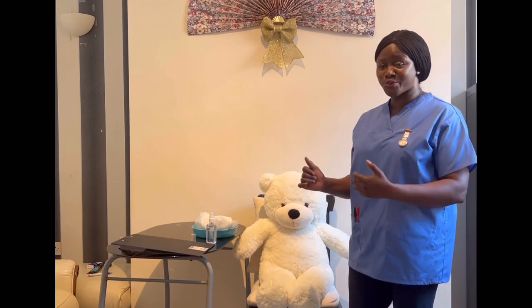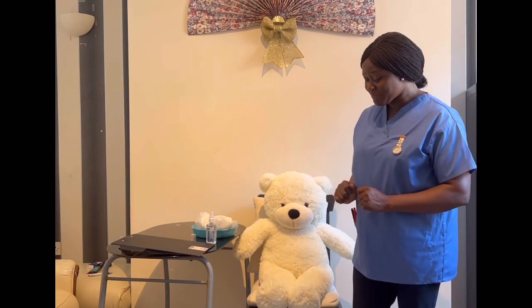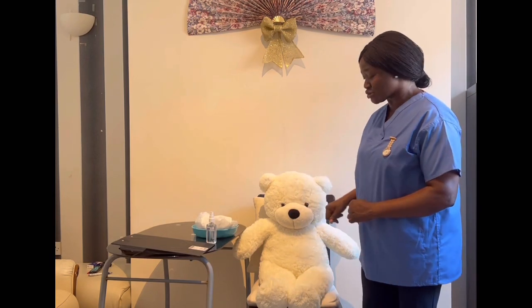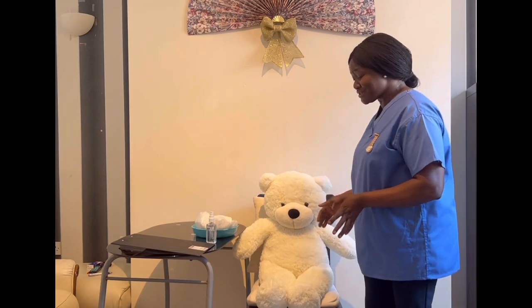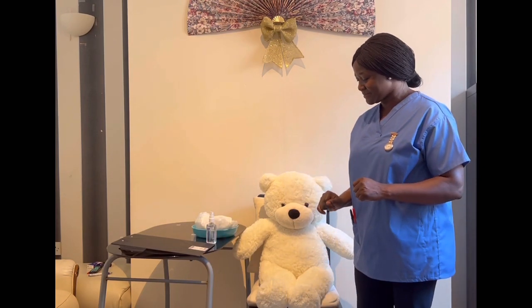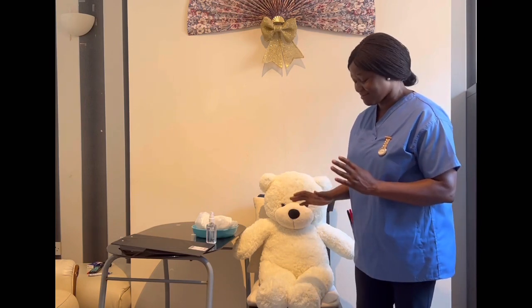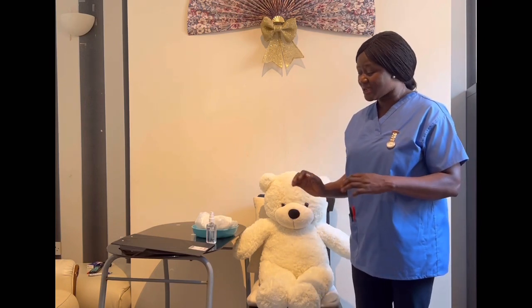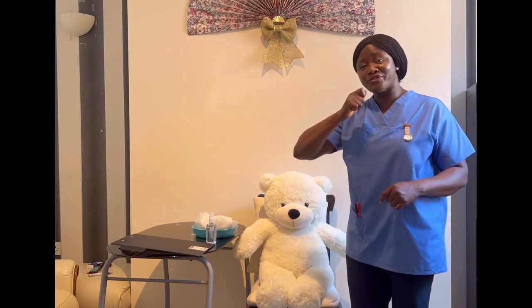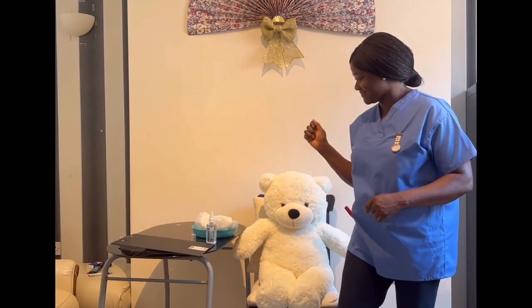As I approach the room, I confirm the room is safe to approach. There is nothing that can constitute harm to myself or to my patient. I'm checking to be sure there's no risk or harm, and if any is noted or discovered, I have to take care of it. I ensure privacy is provided by pulling the curtain.